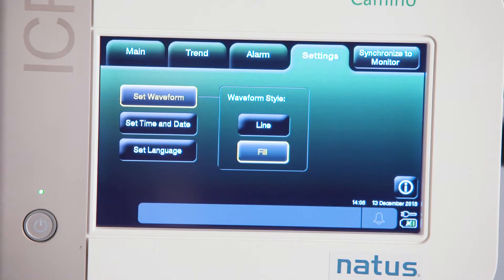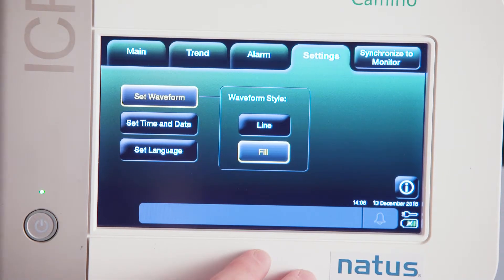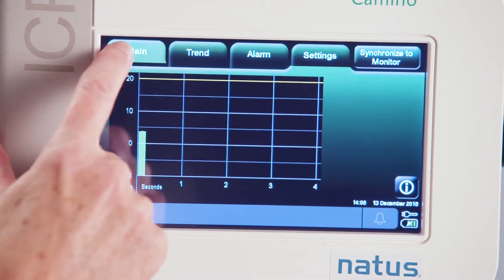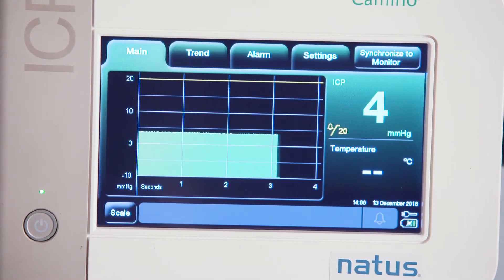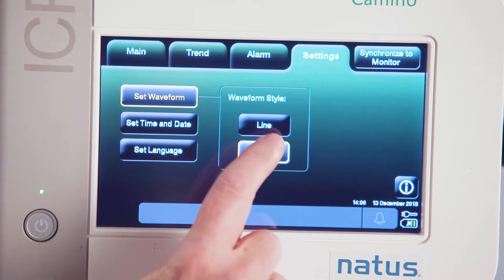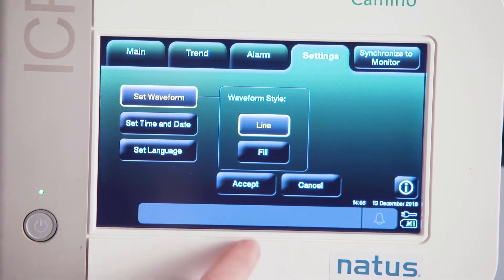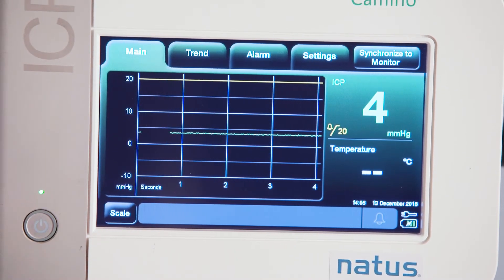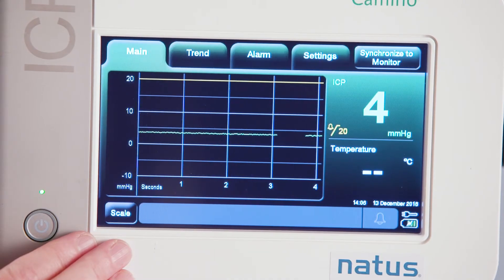The next tab over is my settings tab. This is where I can set my time, date, and language. I can also change what my waveform looks like — it can either look like a single line or it can look like it's filled in. If I go back to my main screen, you can see it looks like a block — this would be fill. If I go into settings and choose line and hit accept, it now looks like a single line on the screen. That's just visually what you prefer to look at.